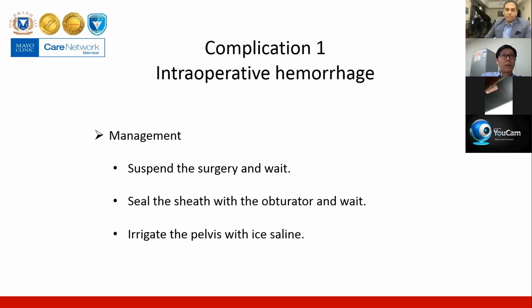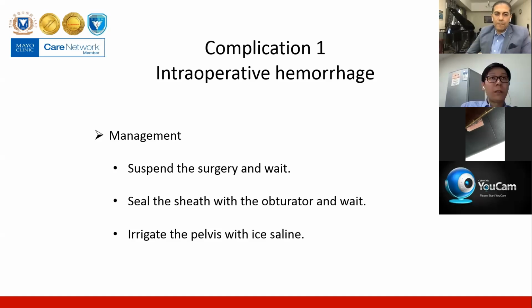Usually 10 to 15 minutes is enough. Then we observe the circumstance of the renal pelvis with a flexible ureteroscope. If the bleeding stops, the surgery can go on. Otherwise, stop the operation and place a ureteral stent, which is a reasonable option. In the case talked about before, we just waited for 10 minutes, then the bleeding stopped, so we could still finish the lithotripsy.